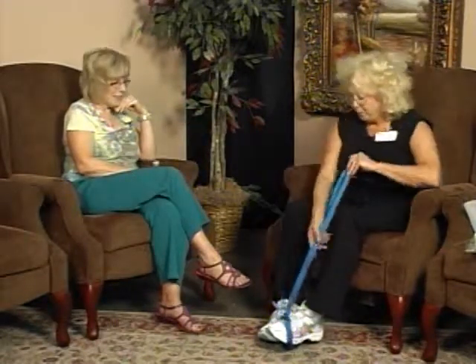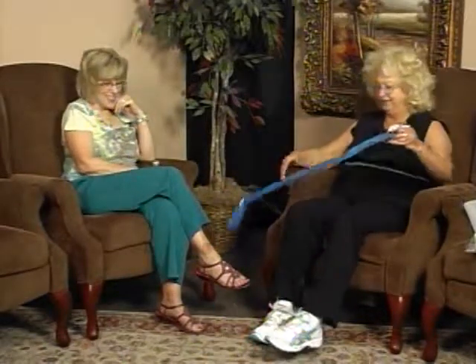And if I need to get up again, then I can put this on, and I can raise my leg, and I can lower it down. And do it safely. Yeah. Safely. You won't hurt yourself. You're not hurting your back. You're only using your arms and your upper body strength. And these come in different lengths. This is just a standard one, but you can also get them longer if you need them, because when you start dealing with a man who is 6 foot or greater, this is not gonna work. It's not going to be good enough. He's not going to reach his toes.